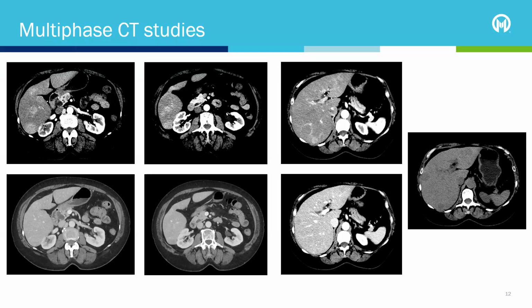Now, if you've got a pulmonary neuroendocrine tumor and no metastatic disease in the abdomen or pelvis, and you're just getting chest CTs for follow-up, that wouldn't be a multi-phase exam. Or maybe if there's something in the pelvis, typically maybe not multi-phase through the pelvis, but for the abdomen, yeah. And that's what we will do here, where we will get the scan for the abdomen, maybe multi-phase, and then through the pelvis, single phase, or sometimes there's tumor in the pelvis as well. We want to see multi-phase everywhere.